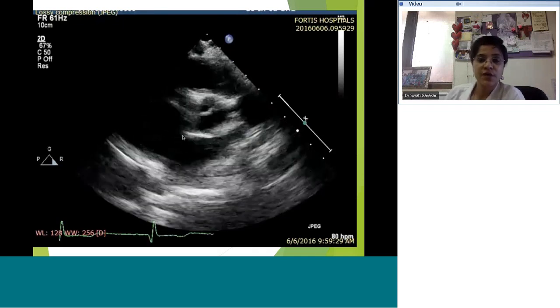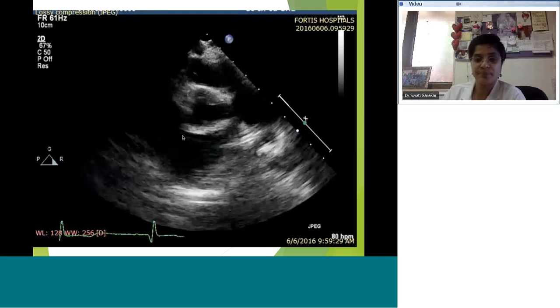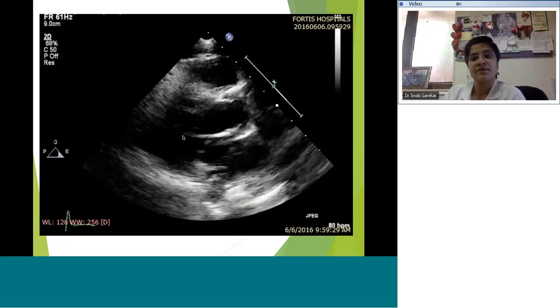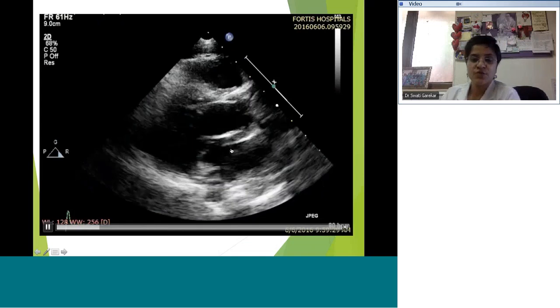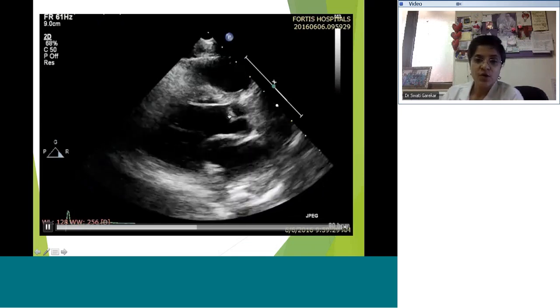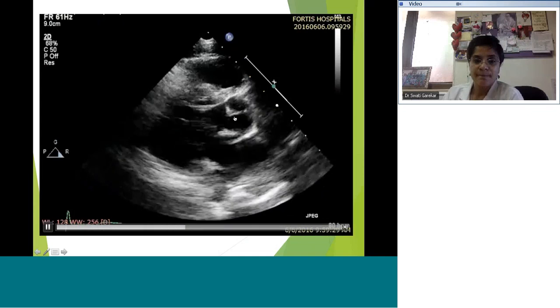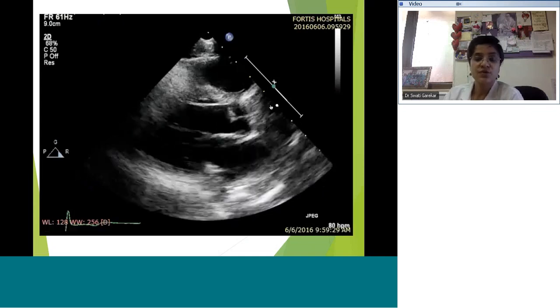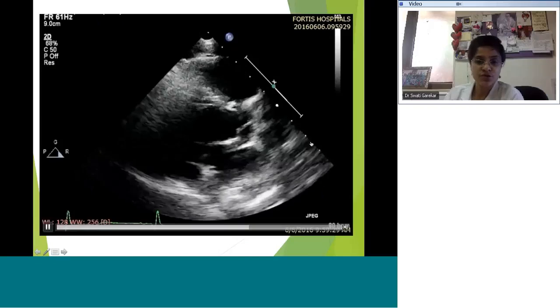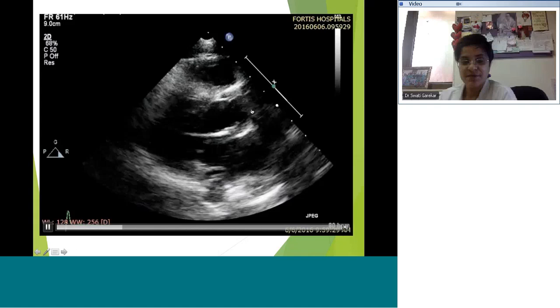All right, so here is a short axis view showing us the aortic valve in the center. Looks pretty all right to me. Here we go. Somebody said 15, which is wrong. So look at the parasternal long axis view. You're seeing the cusps opening, and what we aim to achieve in parasternal long axis is to have the LV laid out across your sector and to visualize enough of the ascending aorta.